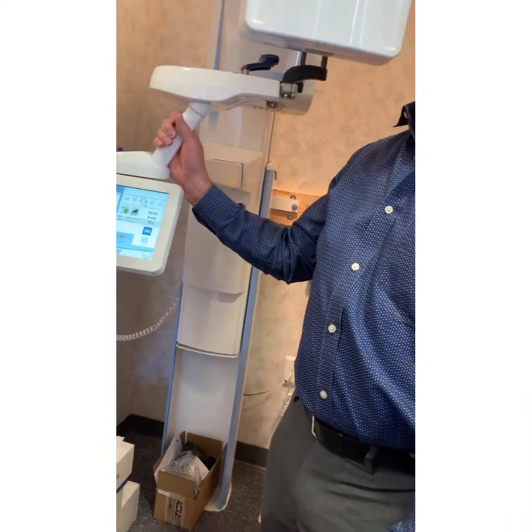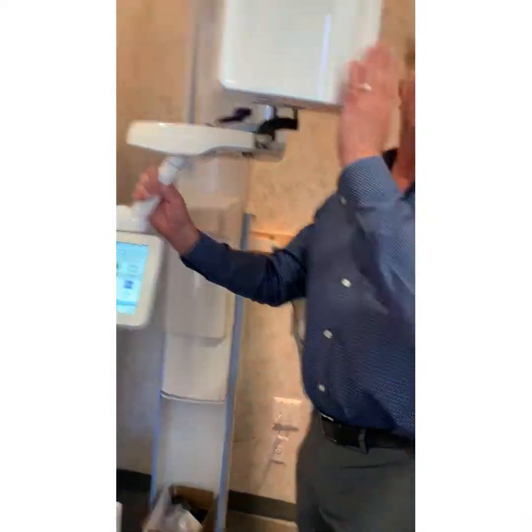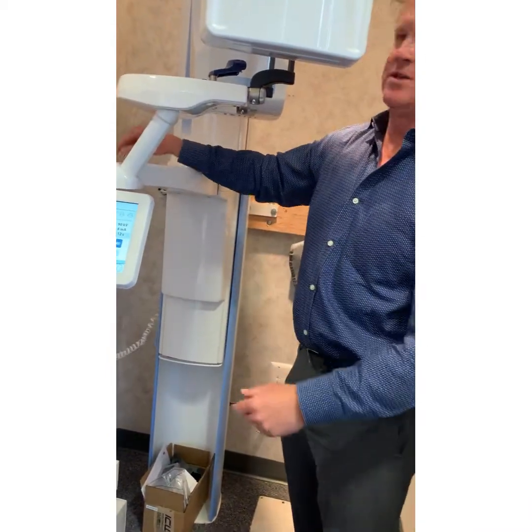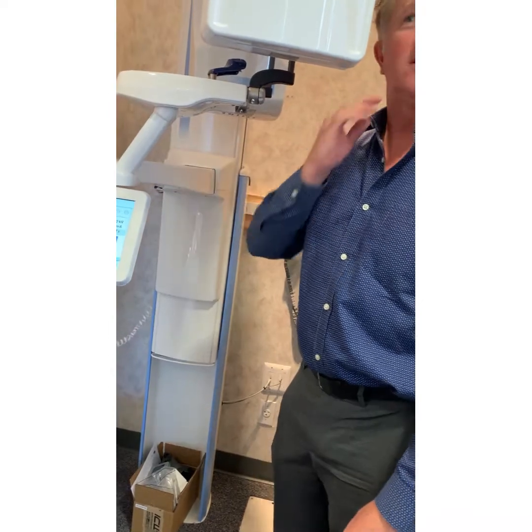So as long as you're behind this wall, you're good. I do think you probably have a point about moving it 2 inches so it can calibrate itself. Yeah, because you don't want to be on the other side. It's just too tight here. You can move it over 2 inches, and you guys can still see this line on my chin. Because that's important, to be able to poke your head through and see.